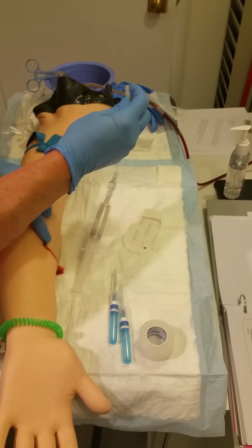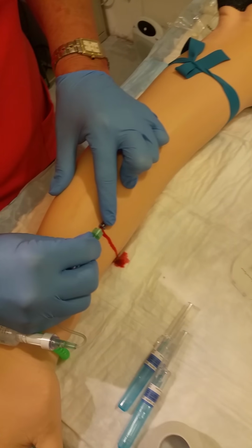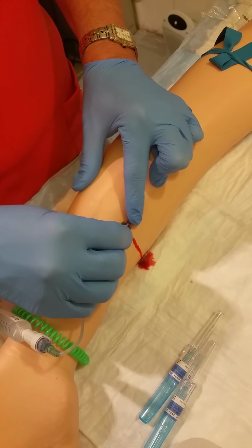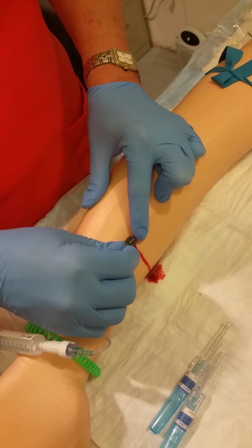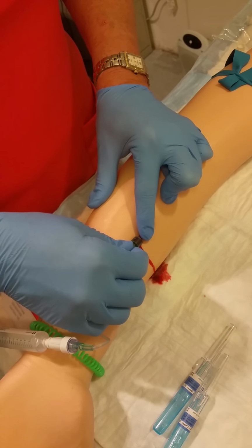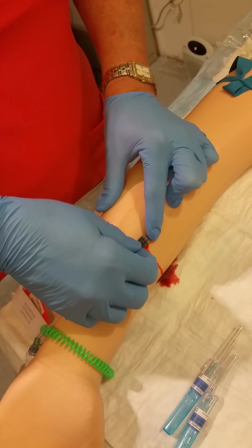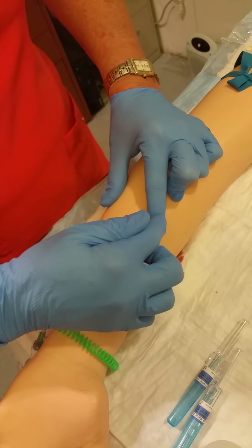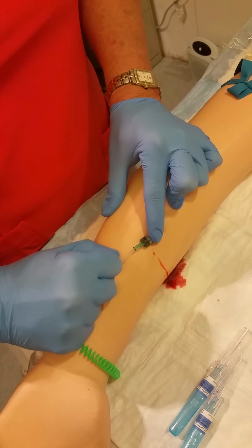I take off the cap, maintaining asepsis, and I connect the extension set to the catheter hub, securing the hub firmly with the index finger of my left hand. I can't let the hub wiggle around. It will occlude the catheter. So while I'm firmly holding the catheter hub with my left index finger, I tighten the extension set on and I don't let go. I open my clip.